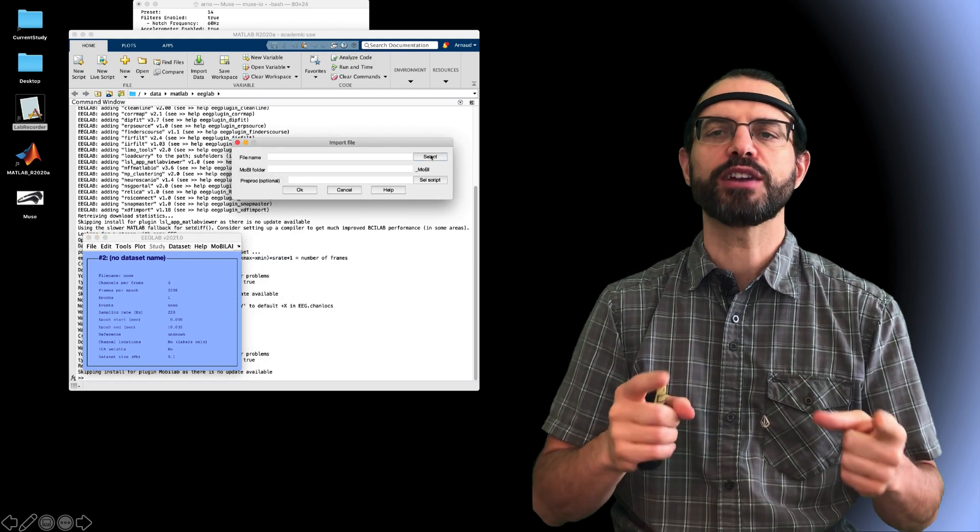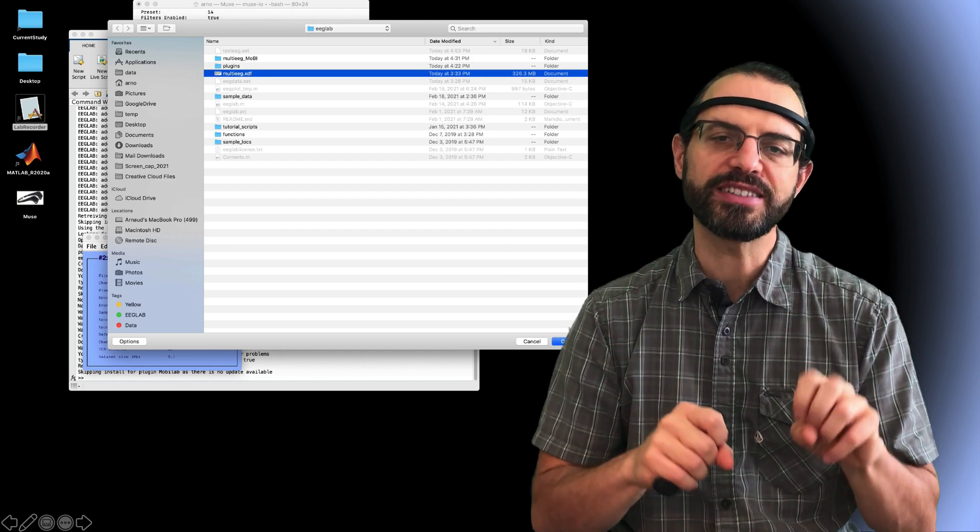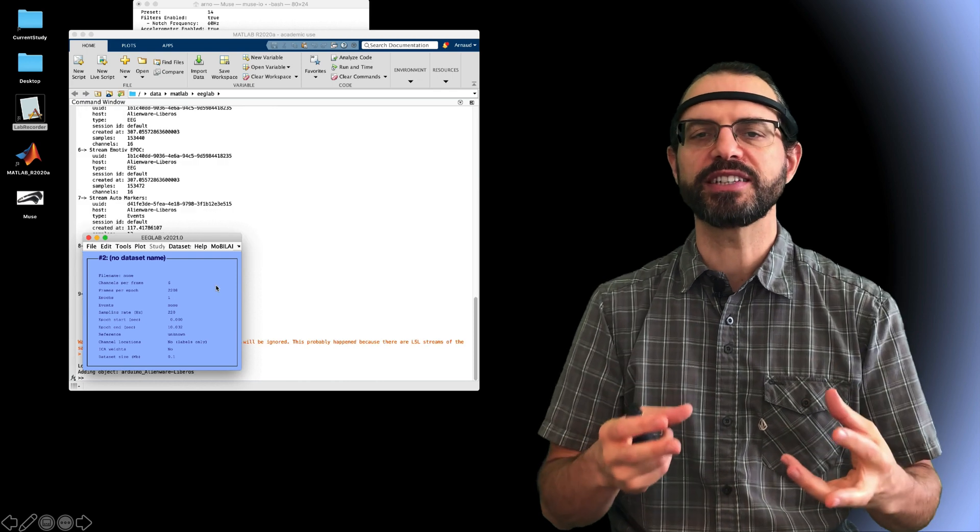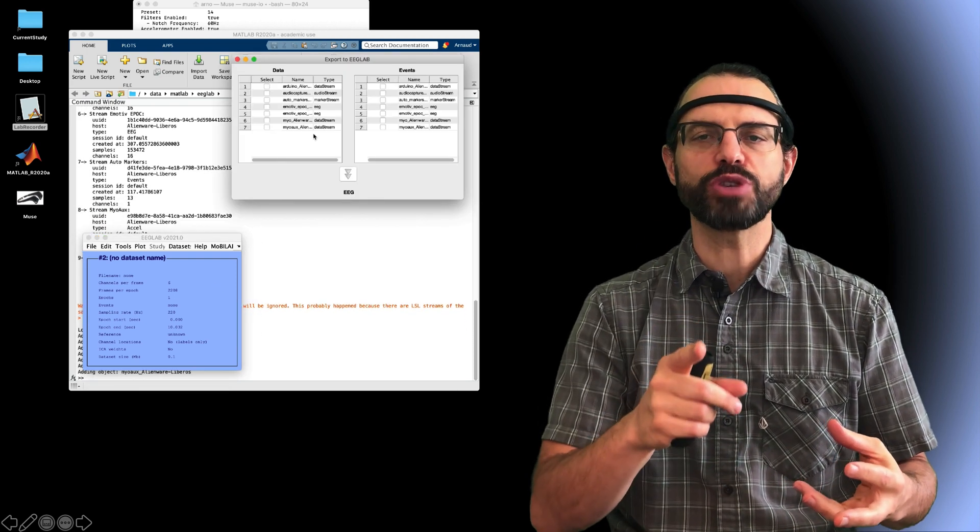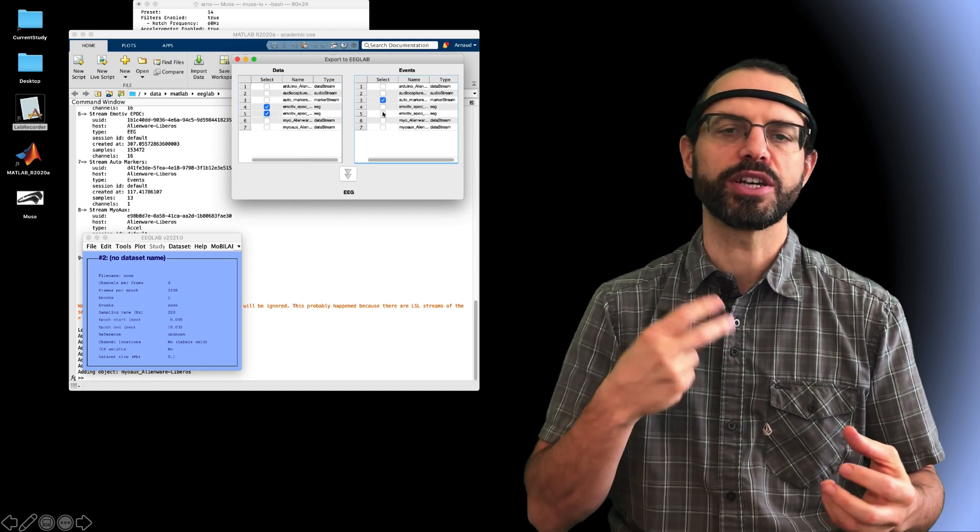So, here I'm going to select a file with multiple streams. This is actually synchronizing two EEG headsets and we also have event streams and other synchronized devices. I will select the two EEG streams in the right column and the event stream in the left column and then press OK.